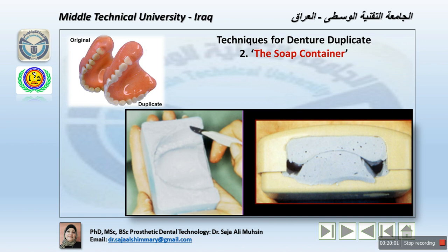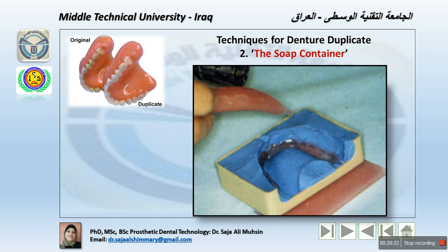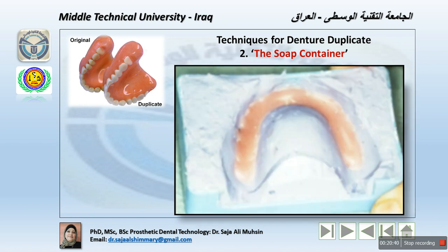The elastic band should be strong enough to make sure that no movement can occur during the pouring procedures. After completing this step, the teeth are replicated in wax by dripping wax onto the teeth horseshoe, and waiting until it is completely solidified and becomes hard. We can notice here, for example, the wax horseshoe representing the teeth.